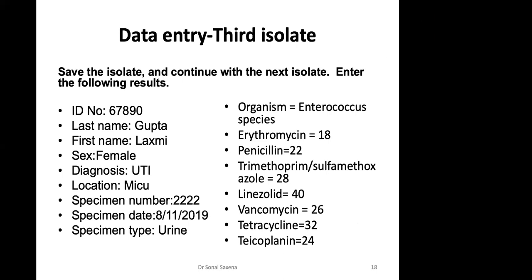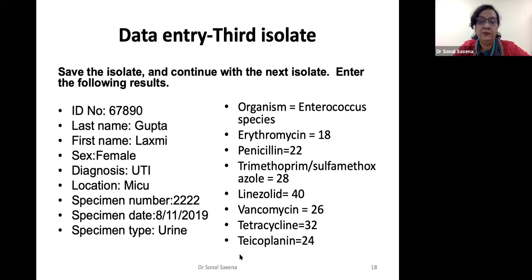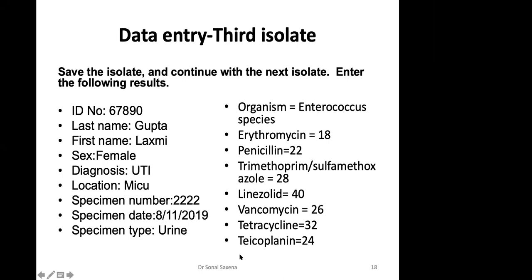So I feel we need senior doctors sitting on the workbenches to do quality assurance, check the zone sizes or the MICs, and make sure they are actually entered, rather than just sensitive, resistant and of course intermediate.